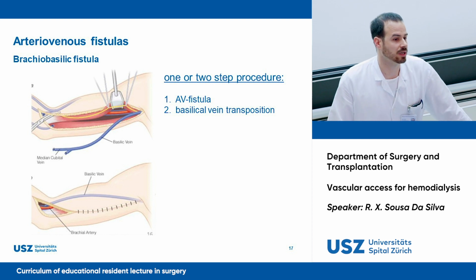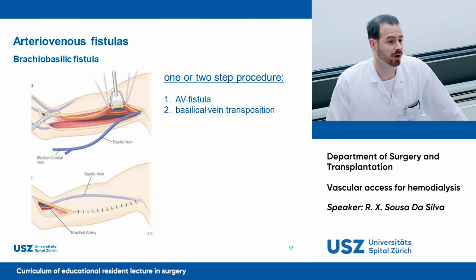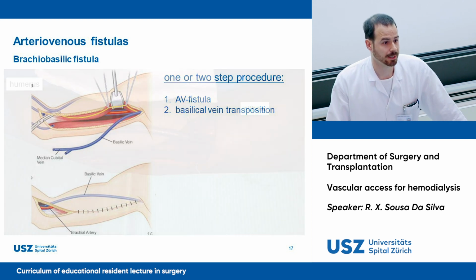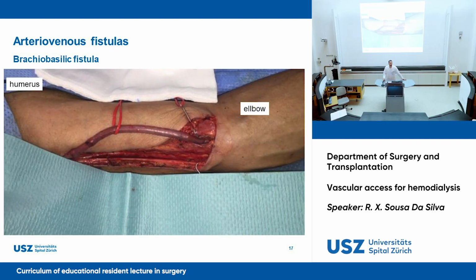This is because it's the more traumatic part of the operation, and if there is no maturation, you did it all for nothing. Here also a picture intraoperatively where you see how it's done.